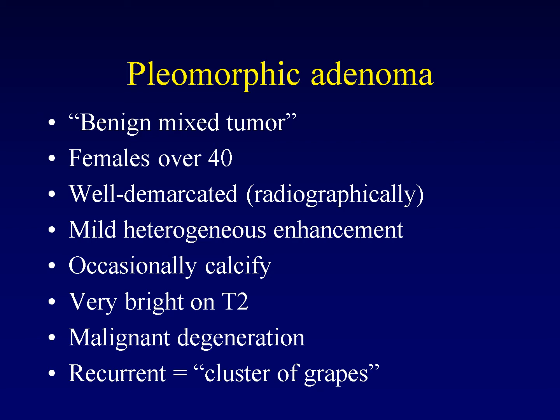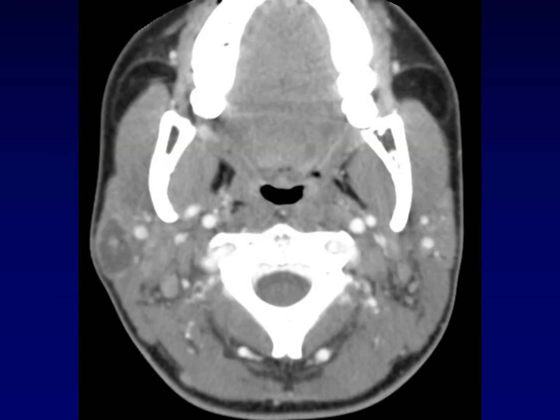When pleomorphic adenomas recur, they recur in a pattern referred to as a cluster of grapes — numerous small rounded recurrences throughout the surgical bed. Here's an example of a pleomorphic adenoma in the superficial lobe of the right parotid gland. You can see it has a rim of enhancement and some heterogeneous central enhancement, and it is well defined. There's nothing specific about this image for pleomorphic adenoma, but it is the most common tumor and would be at the top of the differential diagnosis.